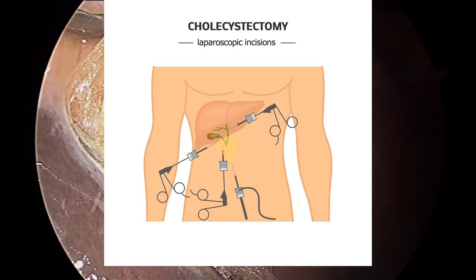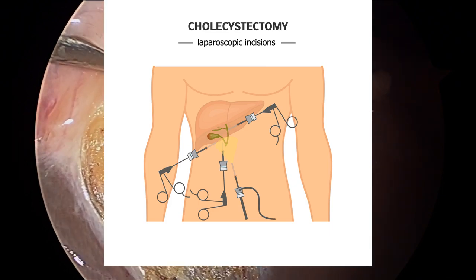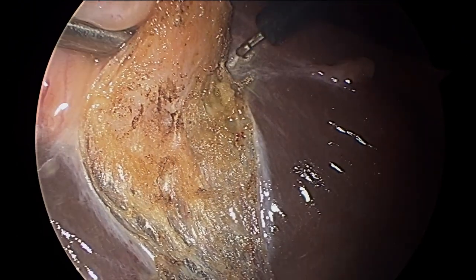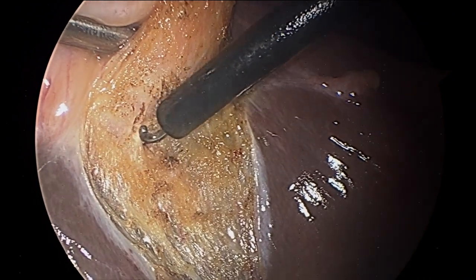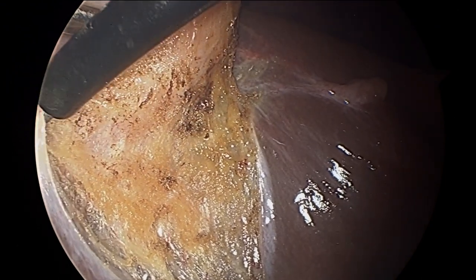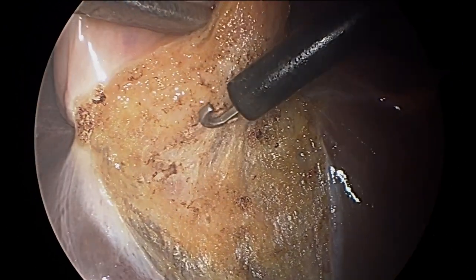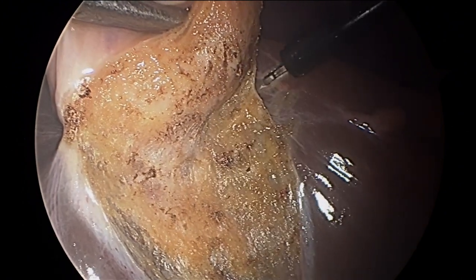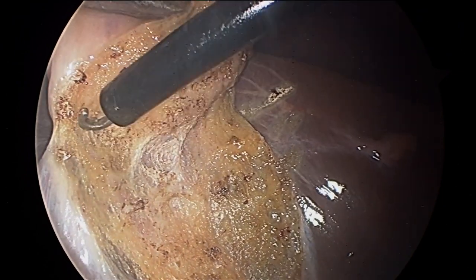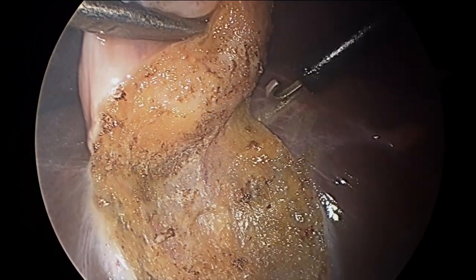You're under general anesthesia during this — you have no pain, you're unaware. The average gallbladder is just a few inches in length and holds about half a cup of bile. It can vary depending on how diseased the gallbladder is. That's the liver on the right of the screen and in the center is that hook cautery. That's still fatty connective tissue that holds the gallbladder to the liver — everybody has some, don't worry.